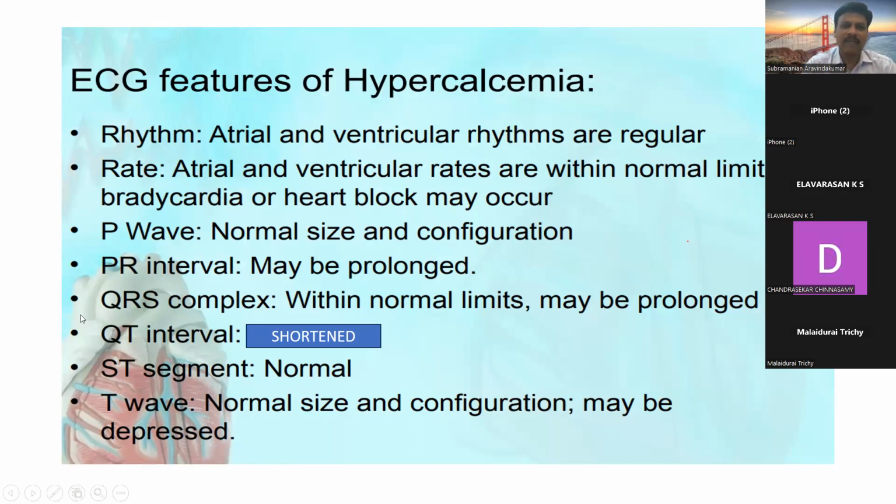See here, everything is normal. Atrial ventricular rhythm will be regular. Rate will be near normal. P wave normal size.